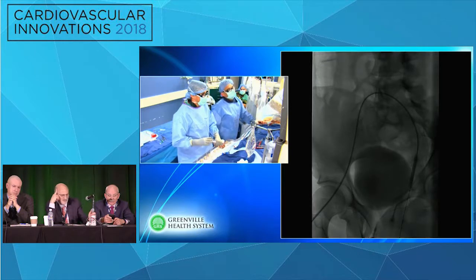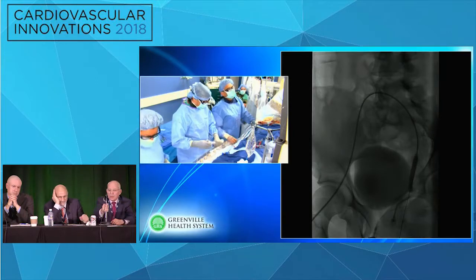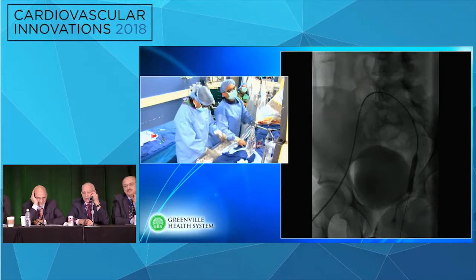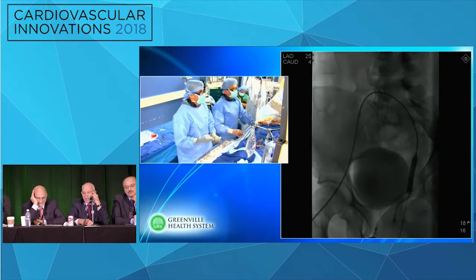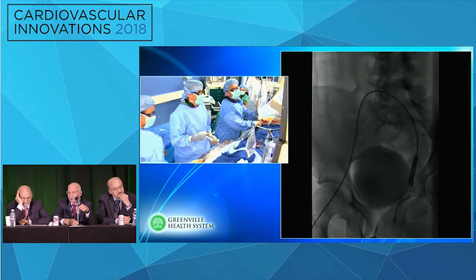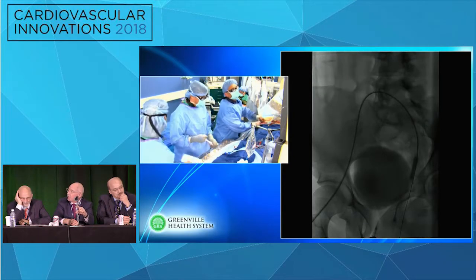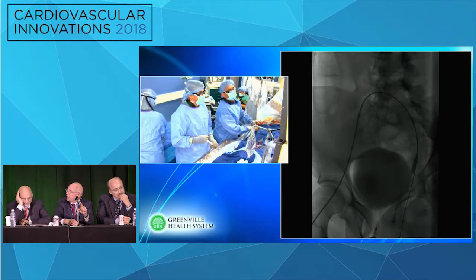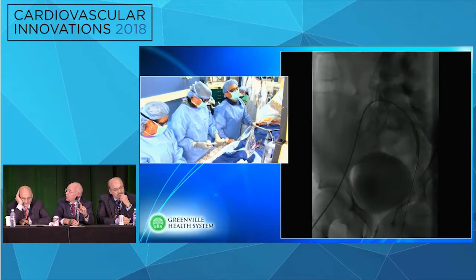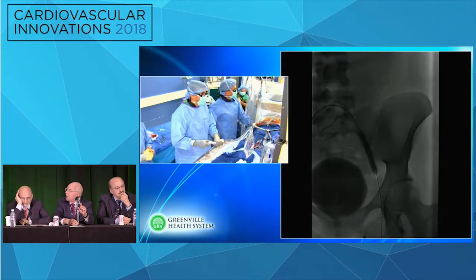So sure. Kenny, how will you deal in this situation with the origin? Pressure on the left common femoral. Yeah, well, I think that if he's going to stent, you almost have to stent. Bruce talked about stenting the femoral segment, or the iliofemoral segment, coming from the contralateral side, and then the ostial segment, the IVC portion, coming retrograde, or antegrade rather, from the left side, because that's really the only way that you're going to be able to nail it.